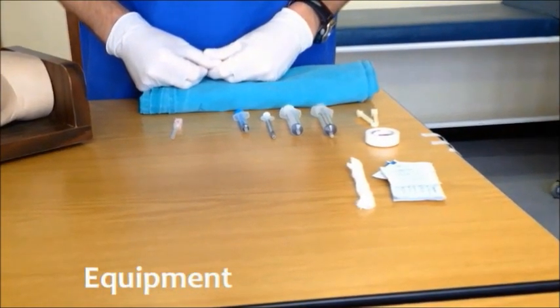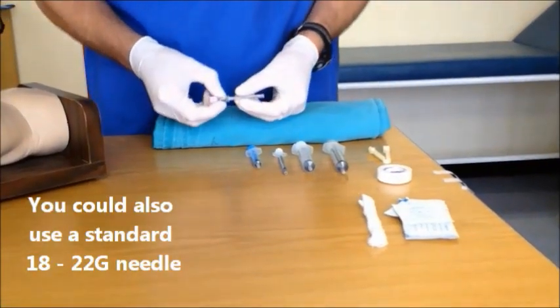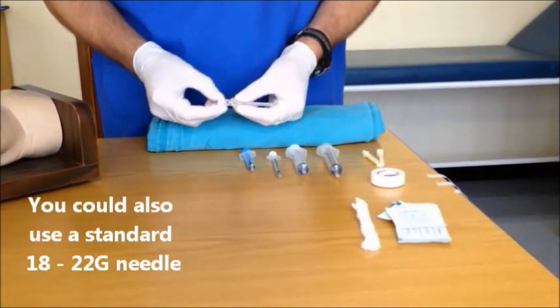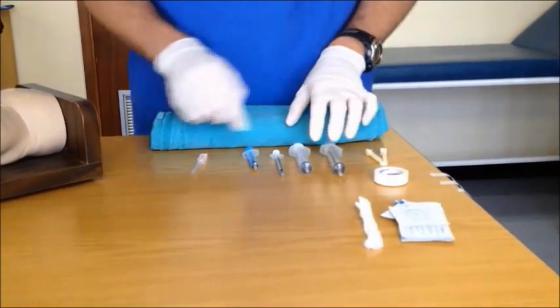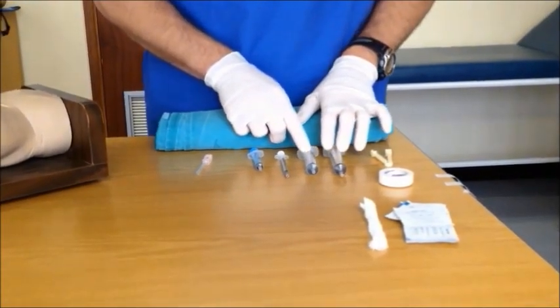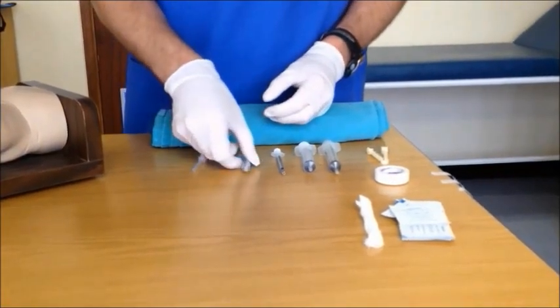these may not be available in the unit where you work. We will show you a technique today using an 18 gauge pediatric spinal needle with stylet, which should be available in most units. You will also need a selection of syringes — 10ml syringes should be fine — and any drugs you require pre-drawn to the dose which is weight appropriate.